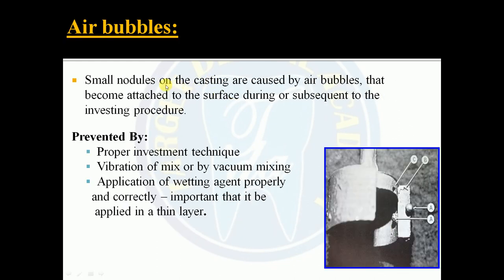Air bubbles. Small nodules on the casting are caused by air bubbles that become attached to the surface of the pattern during or subsequent to the investing procedure. It can be prevented by proper investment technique, vibration of the mix, or by vacuum so that air bubbles can be eliminated. A wetting agent has to be applied properly and correctly, in a thin layer.